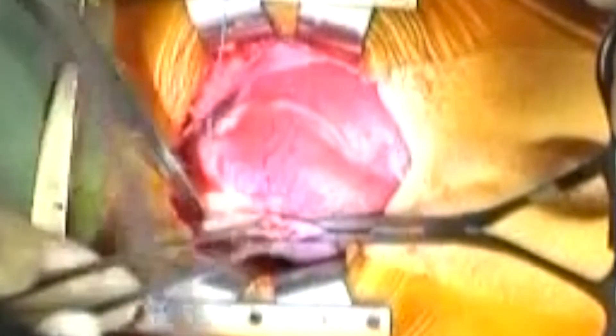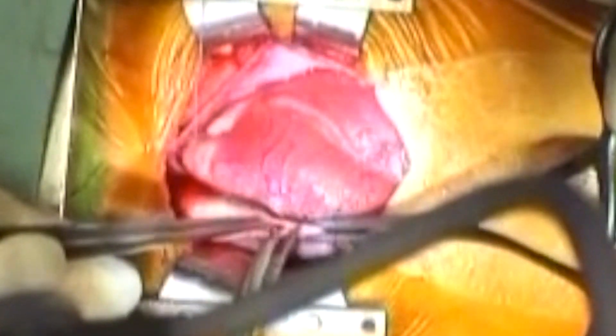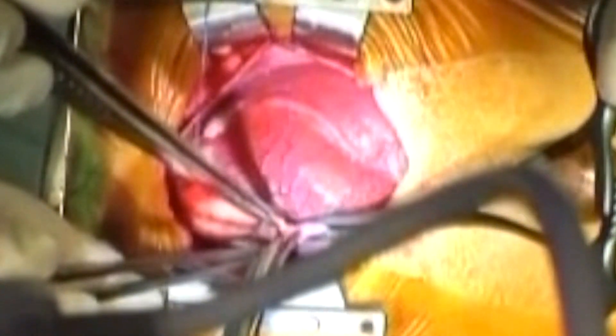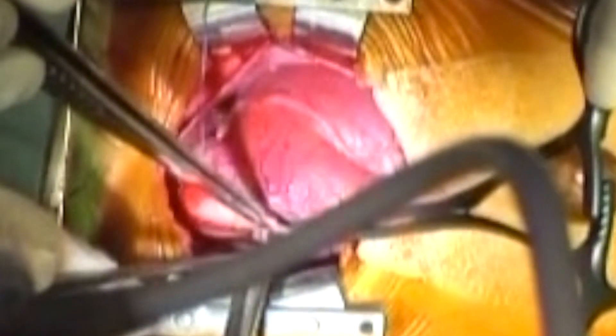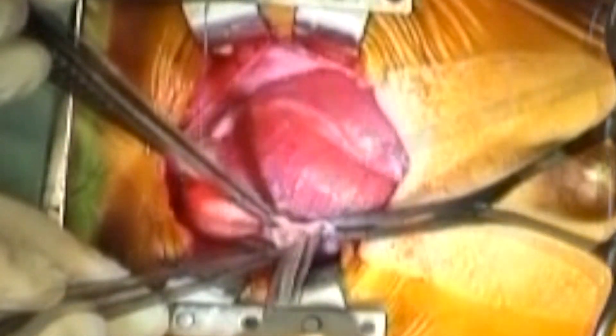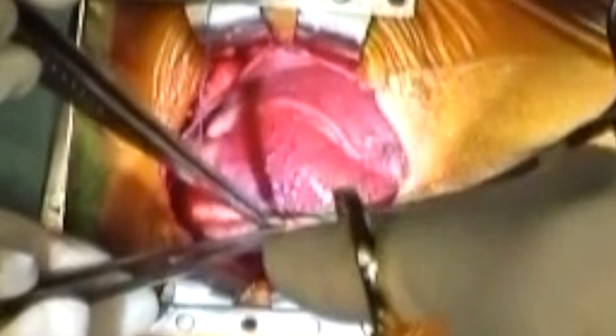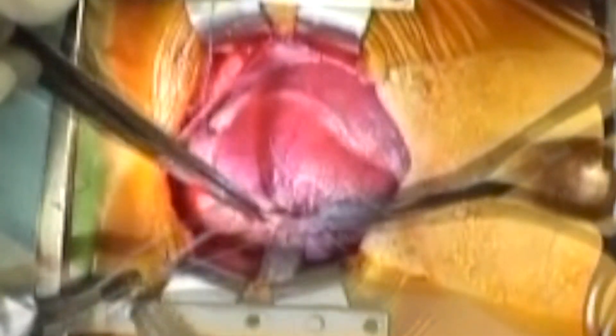An occluding side biting clamp has been placed across the base of the right atrial appendage. The appendage is opened and its insides cleared of any obstructions. Then the opening is encircled with the right atrial purse string.